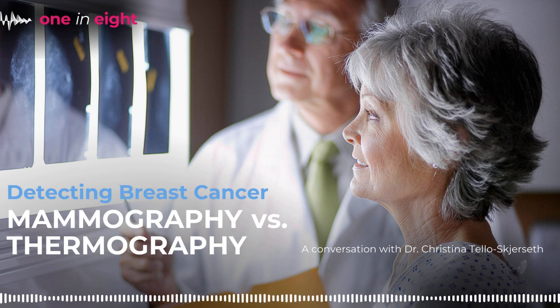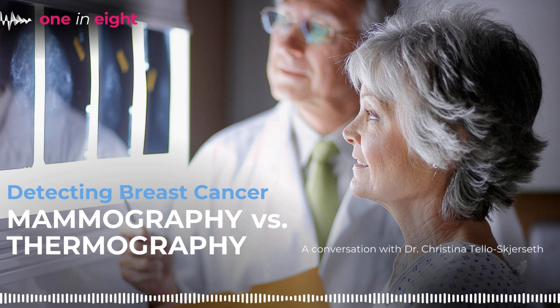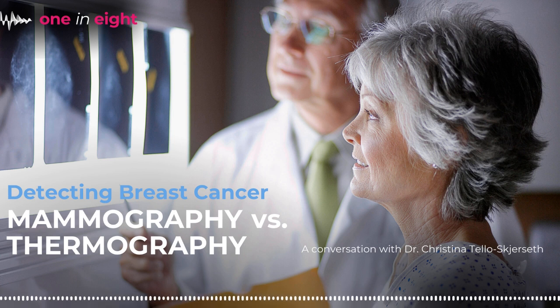Thermography is a different type of exam. It's actually like a heat sensing camera that can take the temperature of the skin surface and then make a different pictorial representation of that. So it doesn't actually show anything inside the breast, doesn't really show you any detailed anatomy. And it's FDA approved because of its safety profile. It's a safe technology, but it's not approved because of its efficacy. So we actually don't use thermography to detect breast cancer. It's really just sensing temperature on your skin.